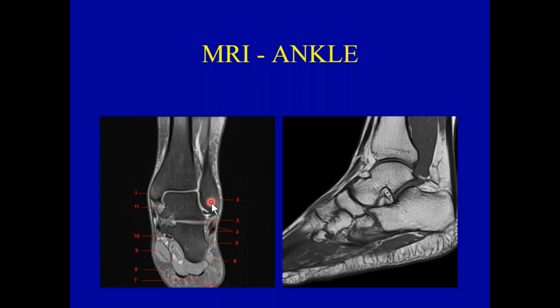On the lateral perspective of the calcaneus, we can tell whether the heel spur that we saw in the plain film is actually irritating the tendon. So is there plantar fasciitis? There's just a lot more information available, but that's in keeping with the principles of MRI. Anatomy doesn't change, which helps me because I don't have to relearn things, but I have to relearn smaller structures, ligamentous structures, more radiographic detail to provide a more precise diagnosis for the referring doctor.